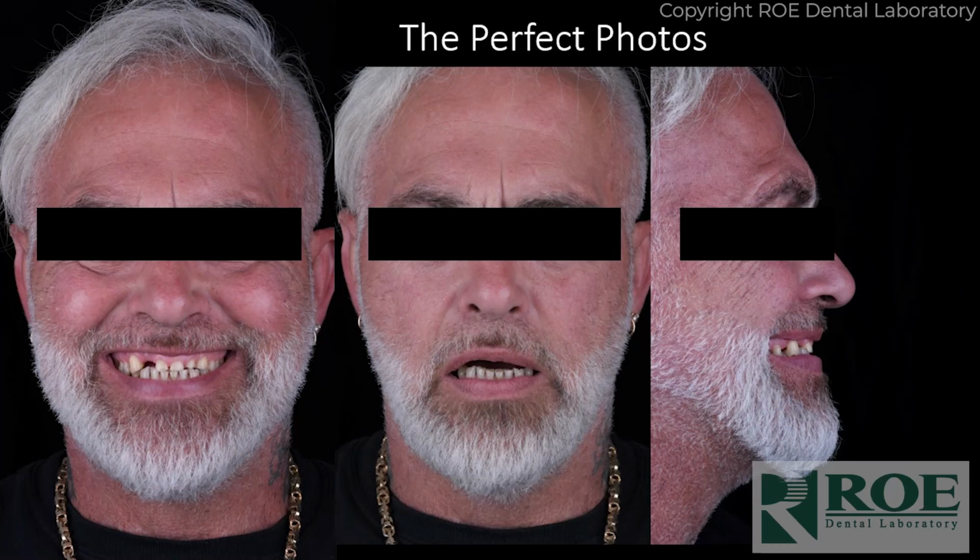Here's an example. It's Dr. Kiefer up in Connecticut. Every time he sends us a case, it's just beautiful, perfect. And he has a photo room, but I've seen him take pictures just like this with the patient turned sideways, sit upright in the chair, eyes in the middle of the orbits, make a big smile, snap, relax your mouth and say, snap. That helps with the low lip line, and then a profile. So nice picture just like that. And you can capture this picture probably with a cell phone just about as good.